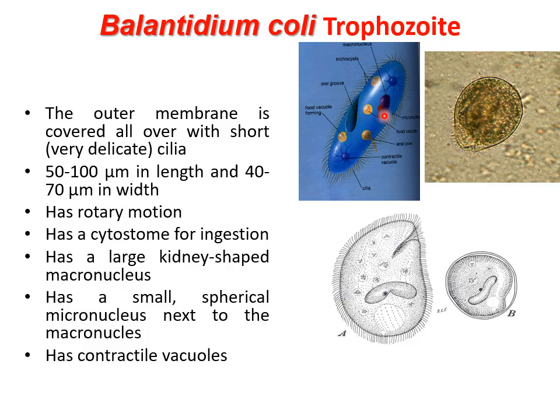We can see in these parasites two nuclei: a macronucleus that has a bean-shaped form and is involved in all the metabolic regulation of the parasite, and the small micronucleus, which is in red here. This micronucleus is located in the constriction of the bean-shaped macronucleus, and it is responsible for reproductive activities. So when you isolate a trophozoite of Balantidium coli in the freshly isolated stool from an infected patient, you can see the cilia that characterize the external surface of this parasite.